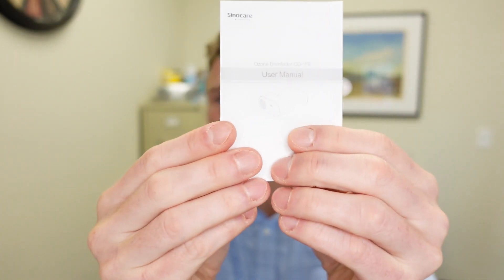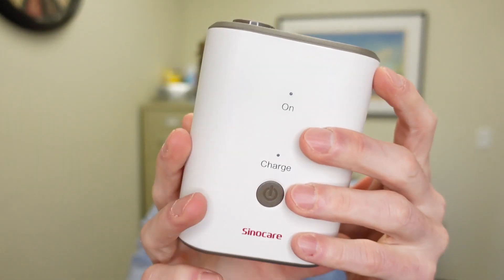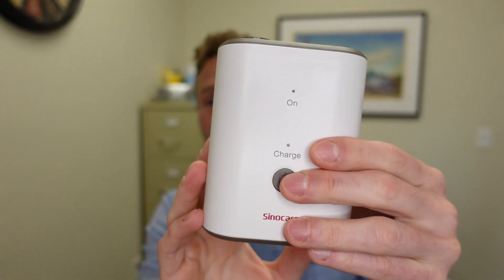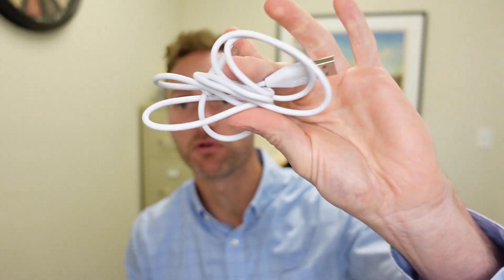What they actually are are these little portable ozone disinfectors. It comes with a little instruction manual. You don't really need the instructions — they're pretty simple to use. This is only about five inches by three inches, so very, very small and portable.